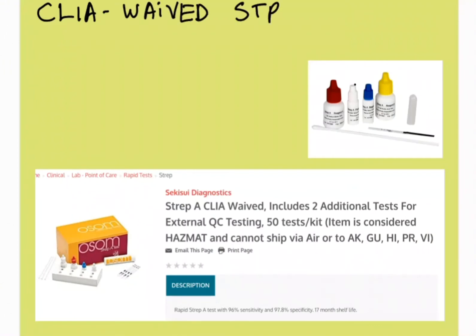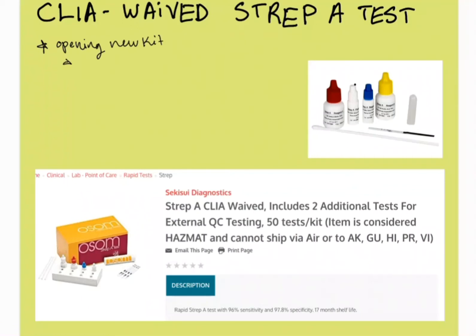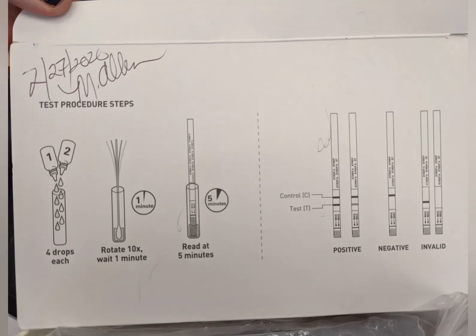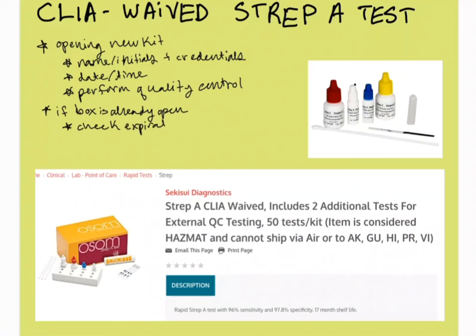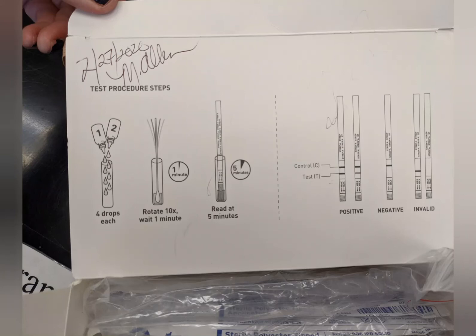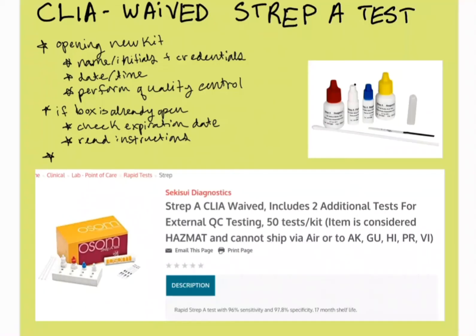As medical assistants, we're allowed to perform CLIA waived tests because a lot of the possible opportunities for error have been removed from the procedure. Whenever you're opening one of the new kits, always initial or write your name on the box somewhere and put down the date and time. Oftentimes in your clinic they'll have you perform a quality control test when you open that box. If the box is already open when you're using it, just check the expiration date and read the instructions, even if you have it memorized. And when you're working with an already open kit, don't combine it with another partial kit, even if you're missing something.